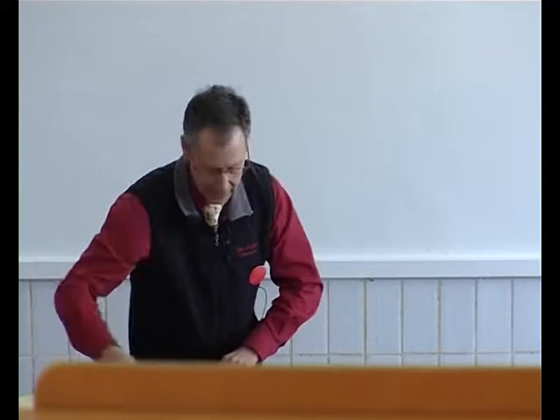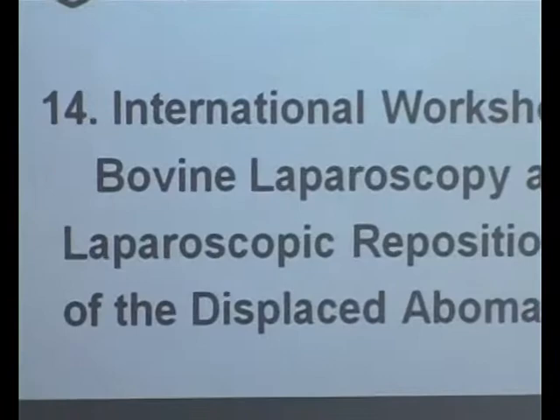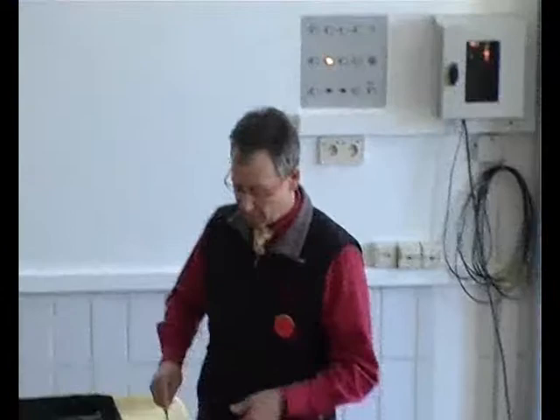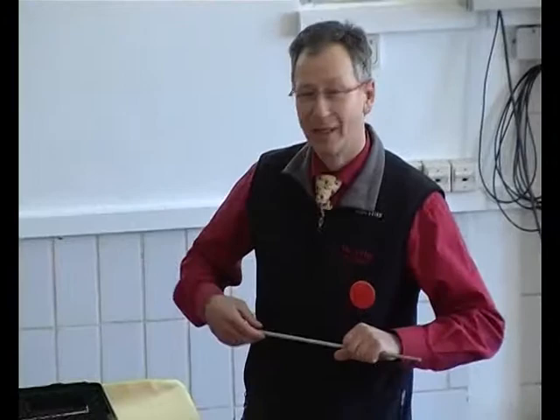The most important parts, and also at the same time most expensive parts, is the actual scope and the light source. The scope is an 8 millimeter scope, 8 millimeter in diameter, and it is specially made for the large animal field because it's very robust, and sometimes my heartbeat gets quicker when I see how the practitioners use this as a breaking stick, but somehow it survives, which is a good sign. So please take this, have a look through.